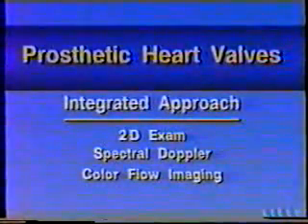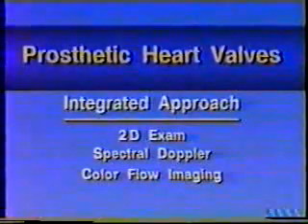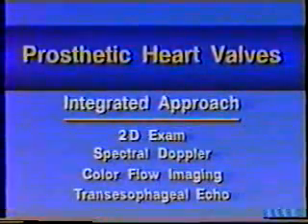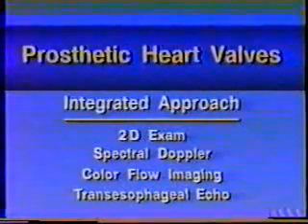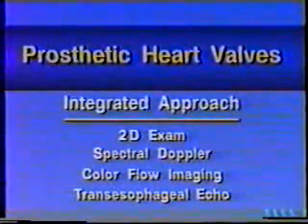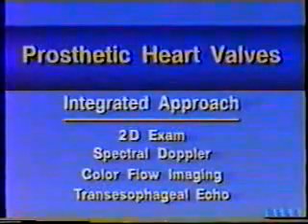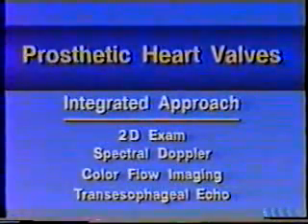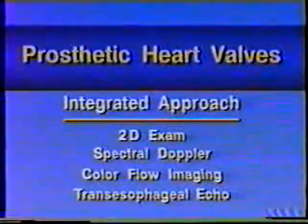This can usually be accomplished with surface echocardiography for aortic prostheses. The new window provided by transesophageal echocardiography allows us to diagnose and semi-quantitate prosthetic mitral regurgitation and is also of great value in imaging valve bed abnormalities such as ring abscess.